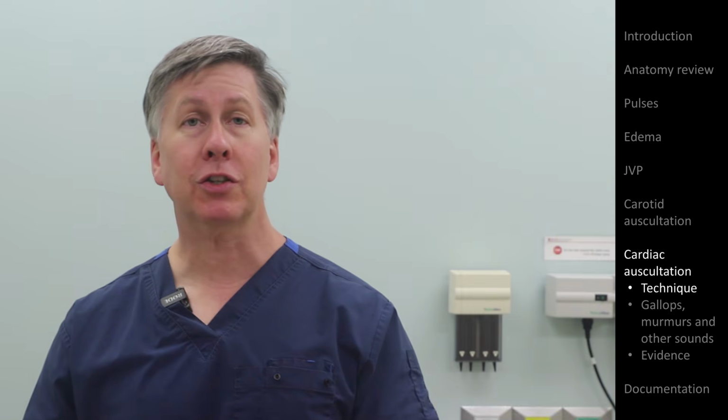When listening to the heart sounds, particularly for trainees, it may be best to focus on just one particular aspect of what you're hearing at a time. So for example, first, just try to figure out the location of systole versus diastole. For patients with a normal heart rate, this can be done by remembering that systole is shorter than diastole.